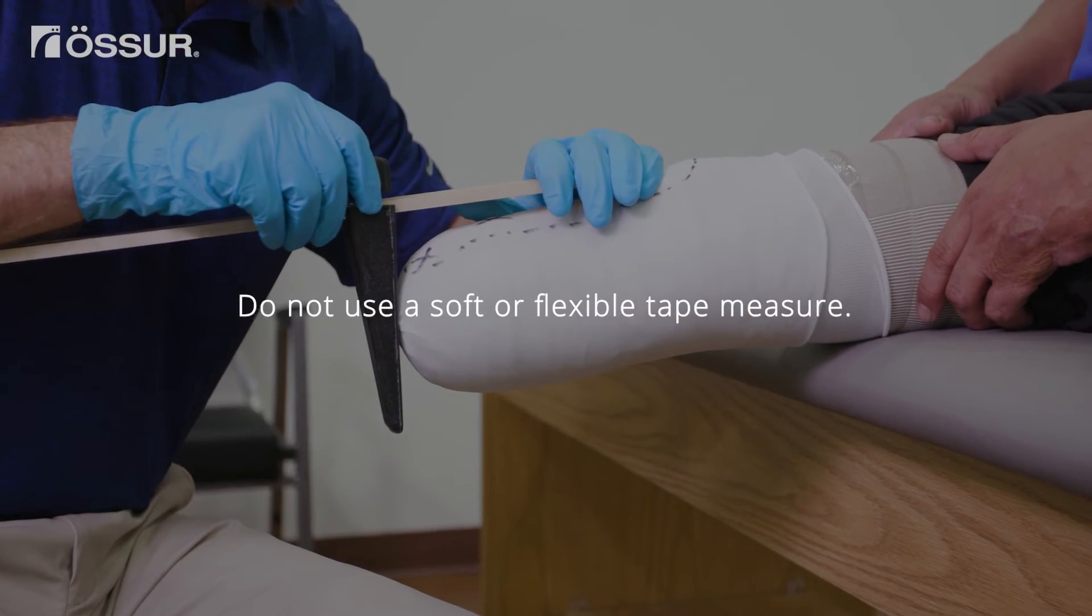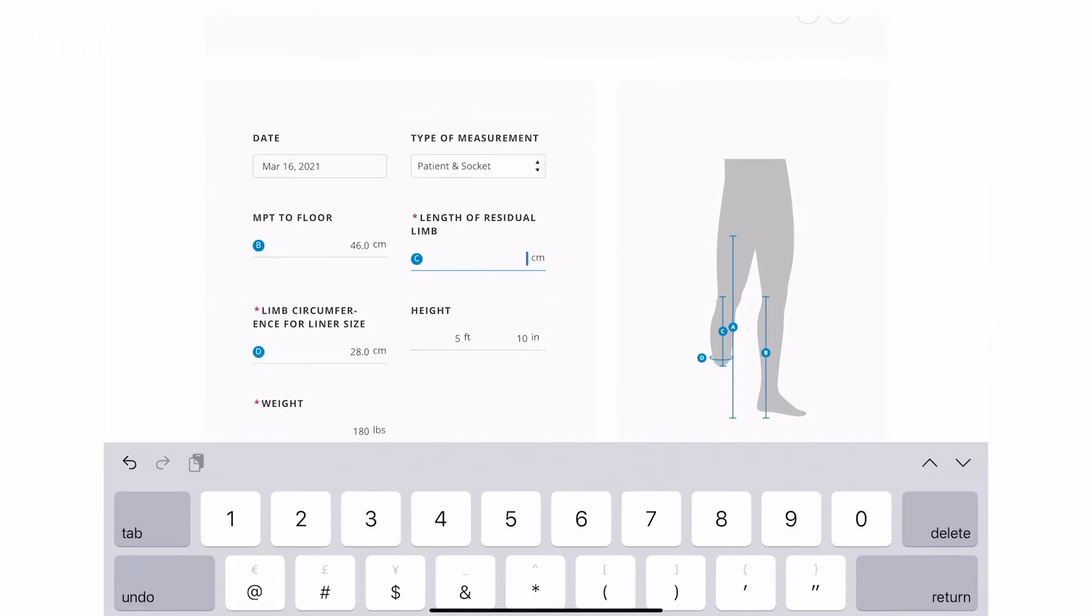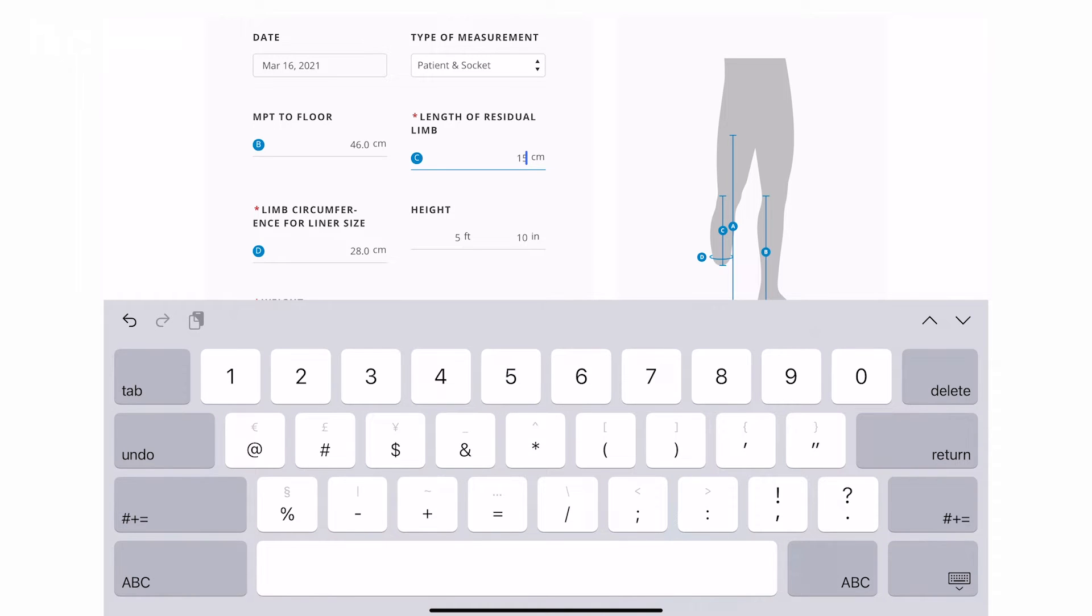Do not use a soft or flexible tape measure and wrap around the distal end. In this case, the total length is 15 centimeters.